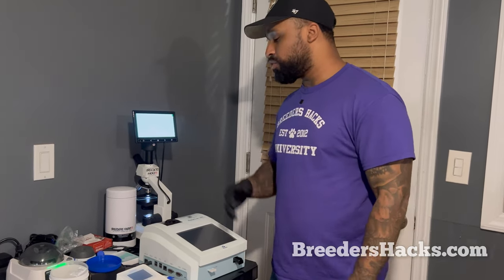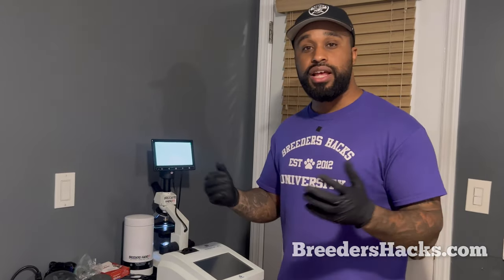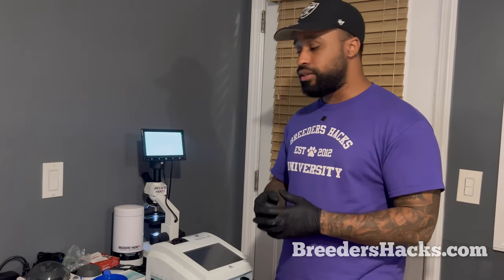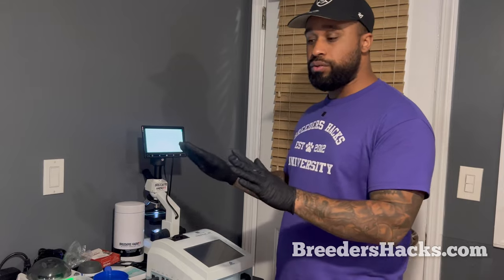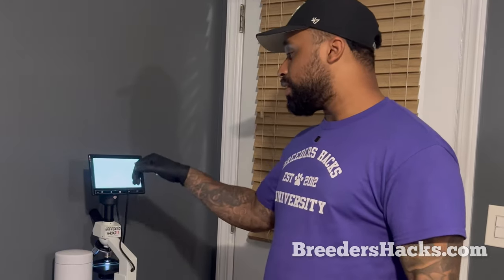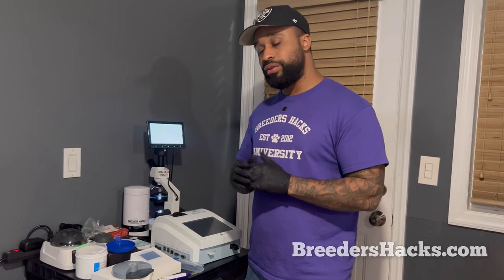But just this quick visual could potentially save you thousands of dollars if you have a shipment sent to you and it doesn't look like this, doesn't look good. To me, this is exceptionally good. This is perfect. I would throw this in the female right away. I mean, I've had collections that looked like this, but then when we looked at it under the photometer, the collections weren't as great. The counts were relatively low. So it's something you just want to be mindful of, guys.